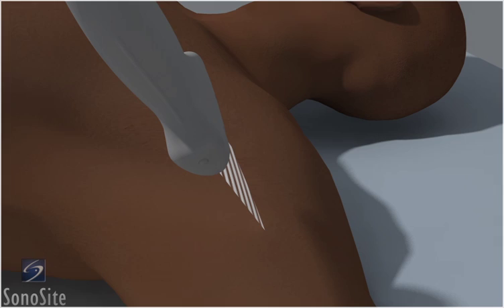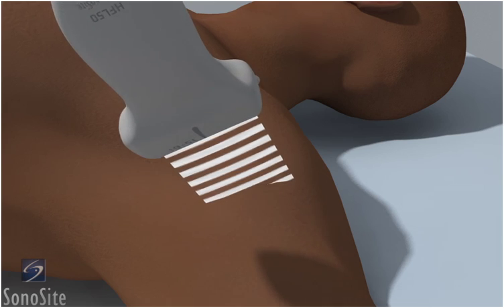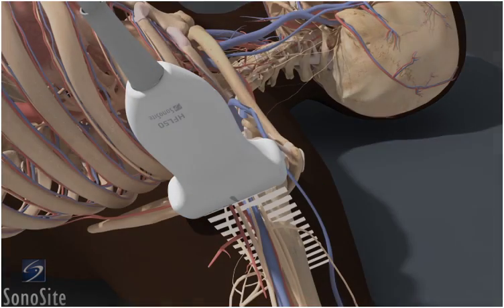The patient is positioned supine with the arm abducted 90 degrees and the elbow bent 90 degrees. The transducer is placed as high as possible in the axilla with the orientation marker directed to the patient's head.